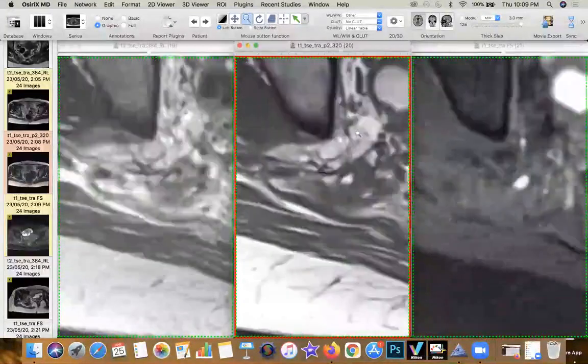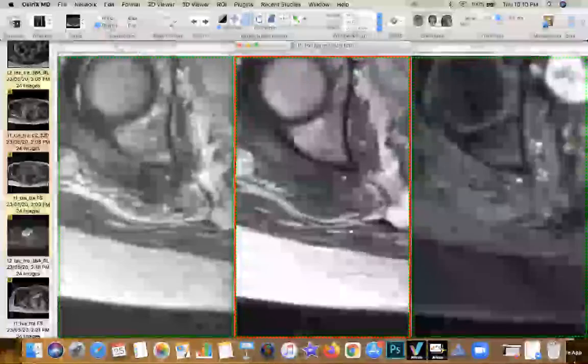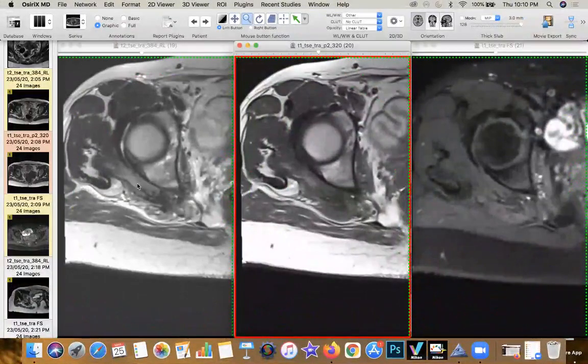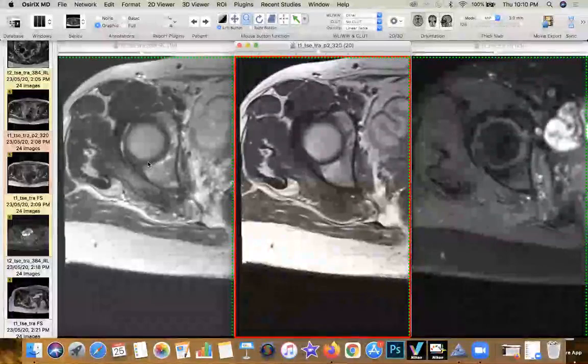Now, this endometriotic tissue can affect not only the plexus, but can get into the retroacetabular portion of the plexus and into the sciatic nerve. And what you start to see, due to the recurrent bleeds, is denervation neuritis, which has happened in the muscles supplied by the lumbosacral plexus. Ideally, these are muscles in relation to the pelvic girdle and the hip joint, and of course then you start to get weakness in the lower limb extremities itself.